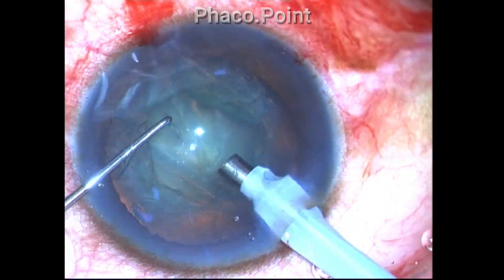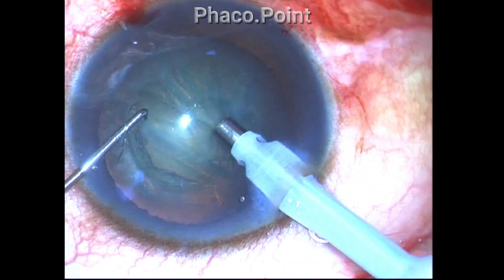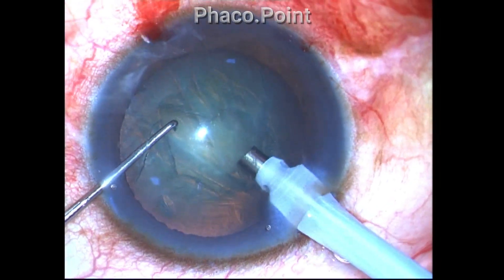The place of impalement of the phaco tip in a grade 1 nucleus sclerotic cataract should be near the center of the nucleus. However, in a grade 4 nucleus sclerotic cataract, the impalement of the tip should be more proximal — closer to the incision.